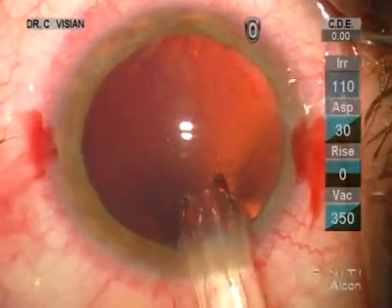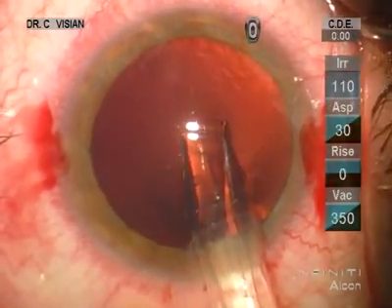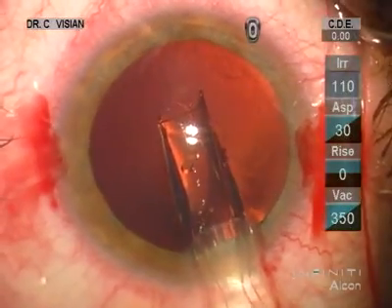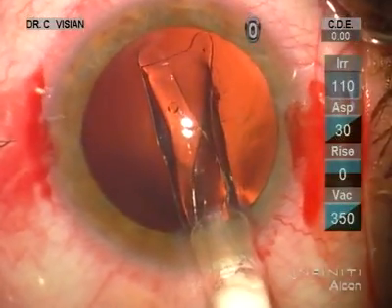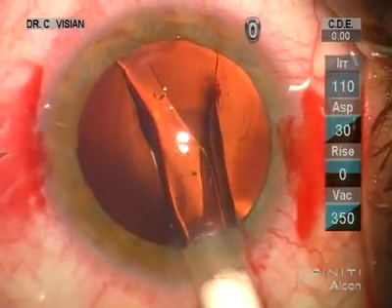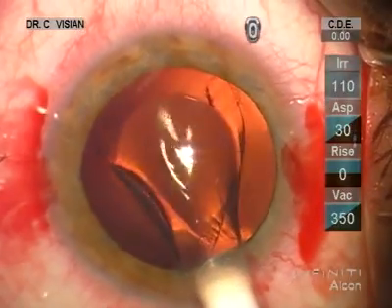We'll just pulse that ICL in, waiting for those leading little mouse ears to unfold. And they did.